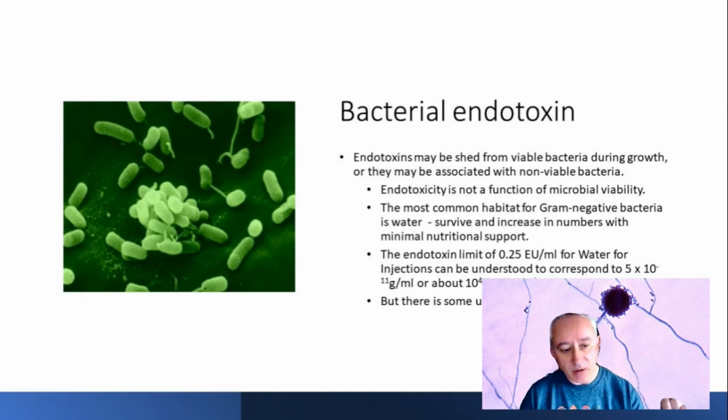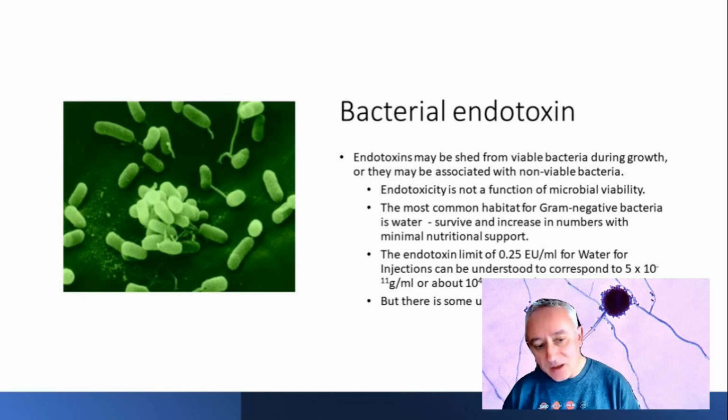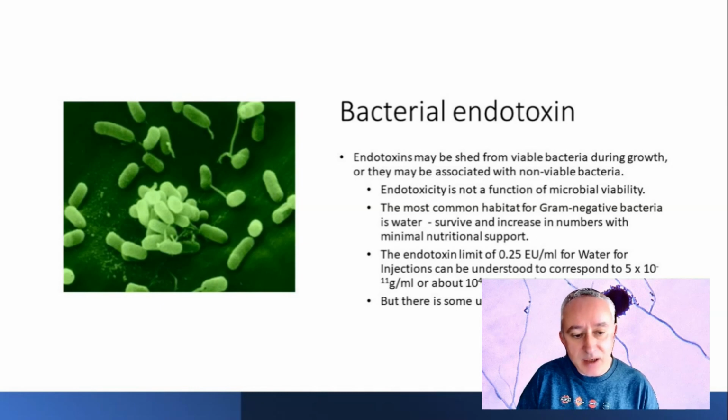To give another idea of how that's expressed, if you take the reference standard endotoxin that we use with the LAL test, then one endotoxin unit is based on around 2 times 10 to the minus 10 grams of lipopolysaccharide. And if we take another measure, if we have endotoxin in water, then that water will have been exposed to high levels of gram-negative bacteria at some point. So if we get endotoxin detection, there must have been a lot of gram-negative bacteria at some point in the past.